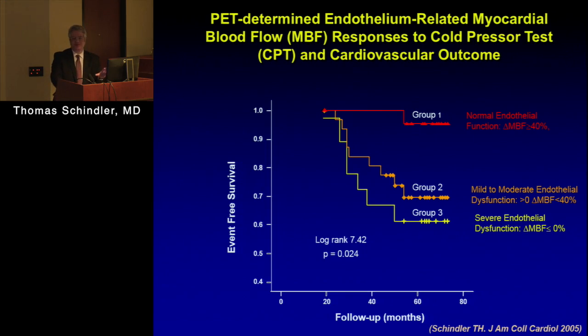So that was the first study actually showing, okay, in patients who have non-obstructive coronary disease that vasomotor function testing with PET could be predictive of cardiovascular event and outcome. At that time, that was very intriguing because we had a SPECT time where they said, okay, normal SPECT perfusion imaging, it's the best predictor. So this was a challenge of the SPECT community at that time.